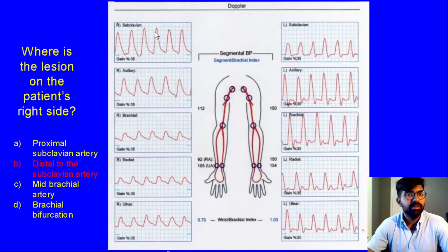Why? Because you don't have a reversal of flow, which again represents decreased peripheral vascular resistance. And this is something I really want to get people honed in on, because quite often someone will listen to this and they'll say, oh, it's a biphasic waveform. There must be something proximal to this lesion. But in fact, as you can kind of see, it is a normal finding in a patient with this disease pathology.